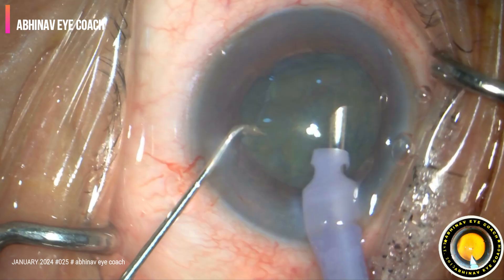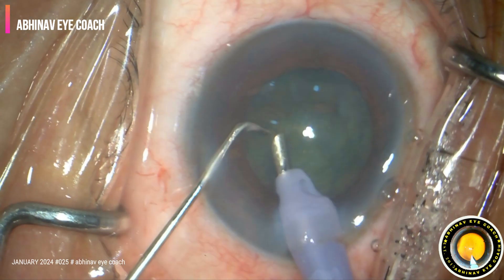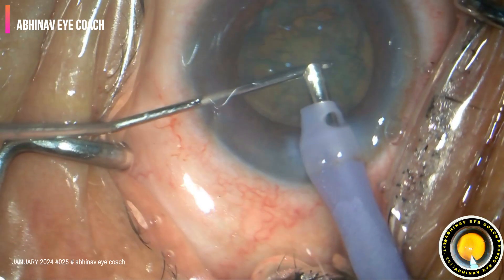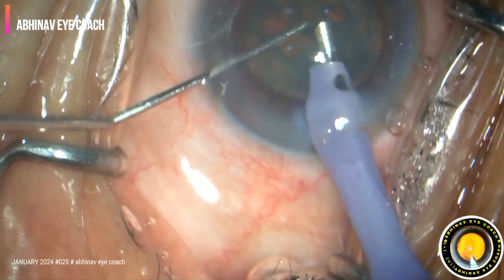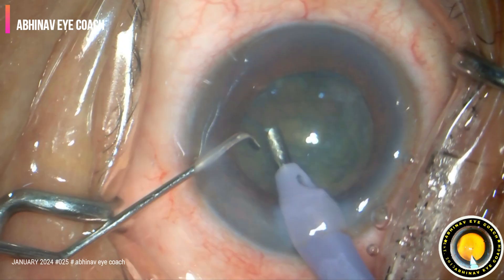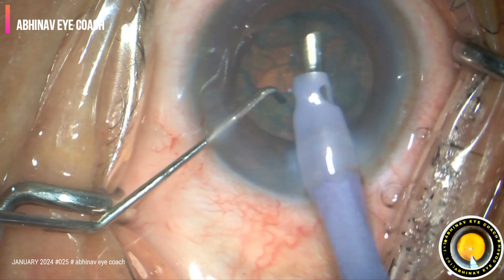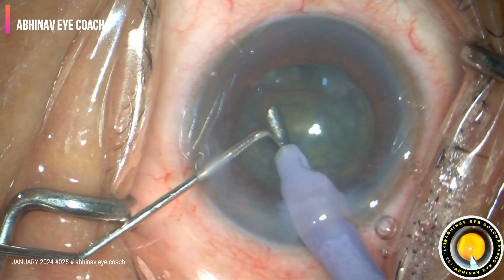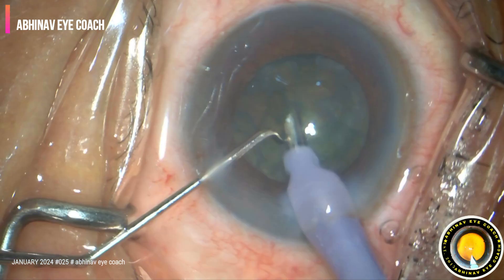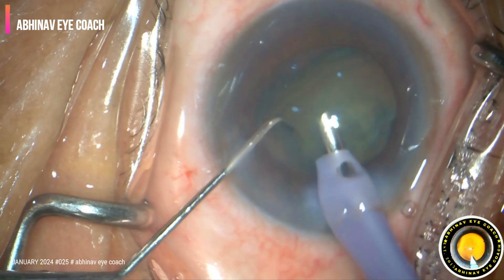Very slowly, phacoemulsification is done. We may not be able to divide the nucleus, but you can see the major chunk — the debulking of the nucleus is achieved. As we get space in the bag after removing a little bit of the nucleus, the nucleus becomes free and the rest of the cataract nucleus is easily taken out.